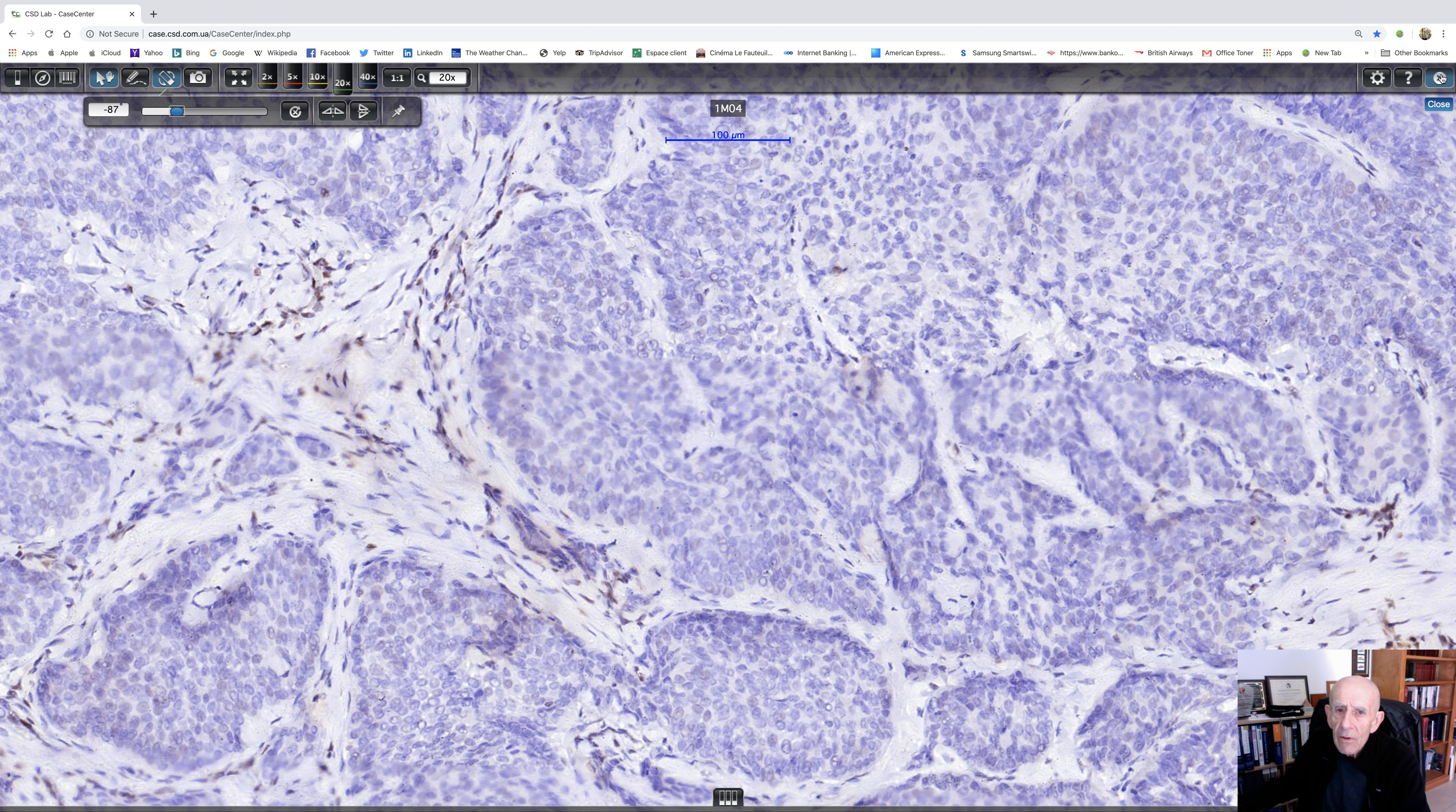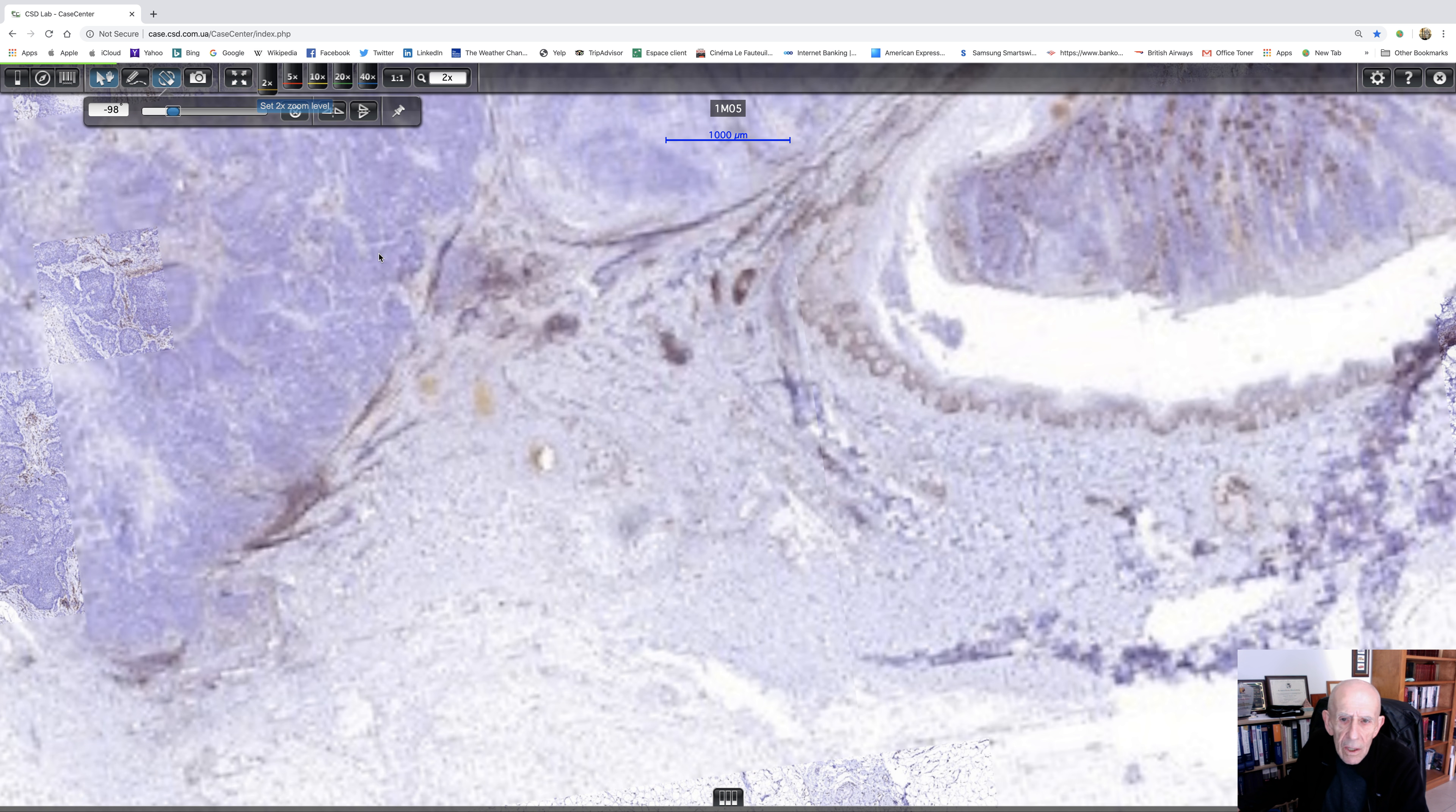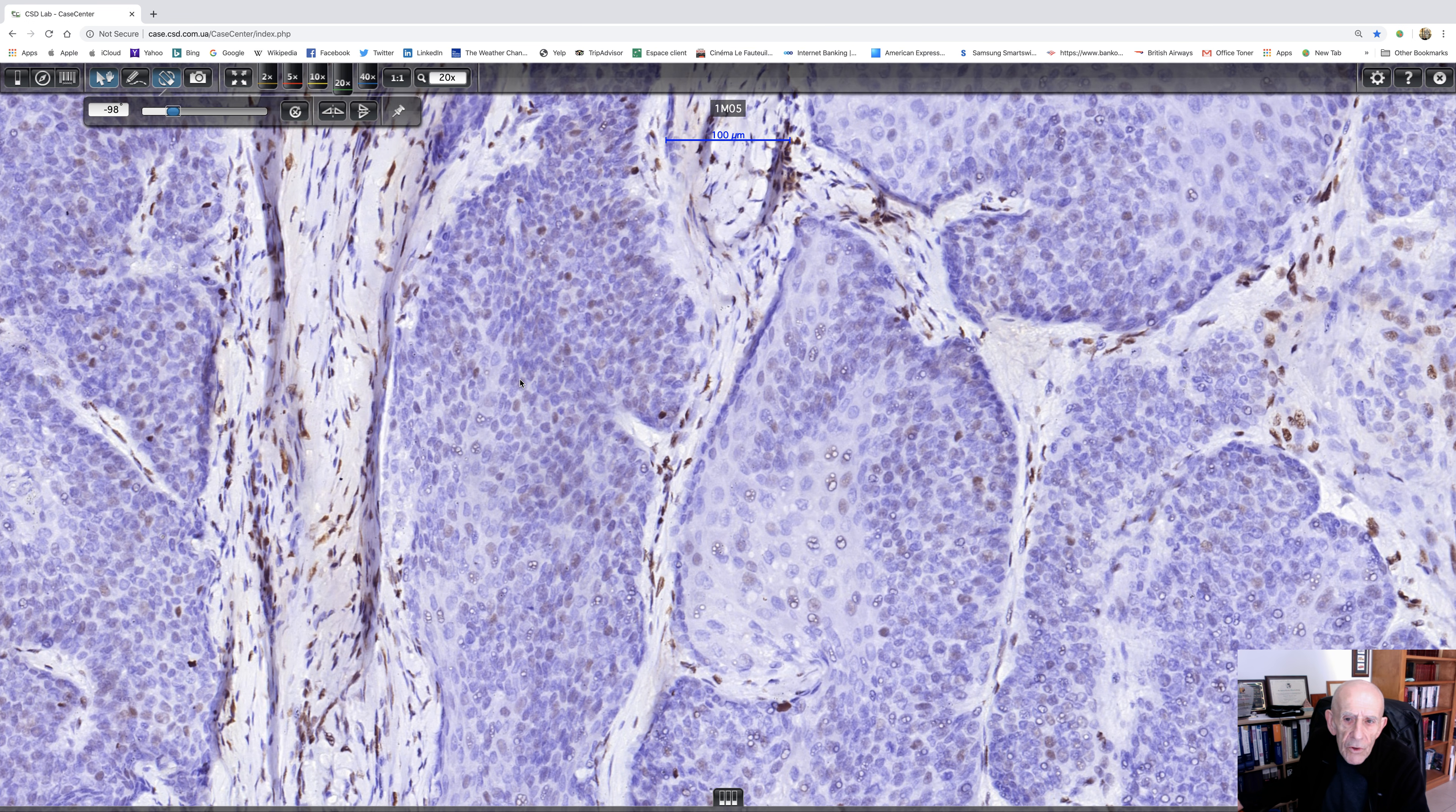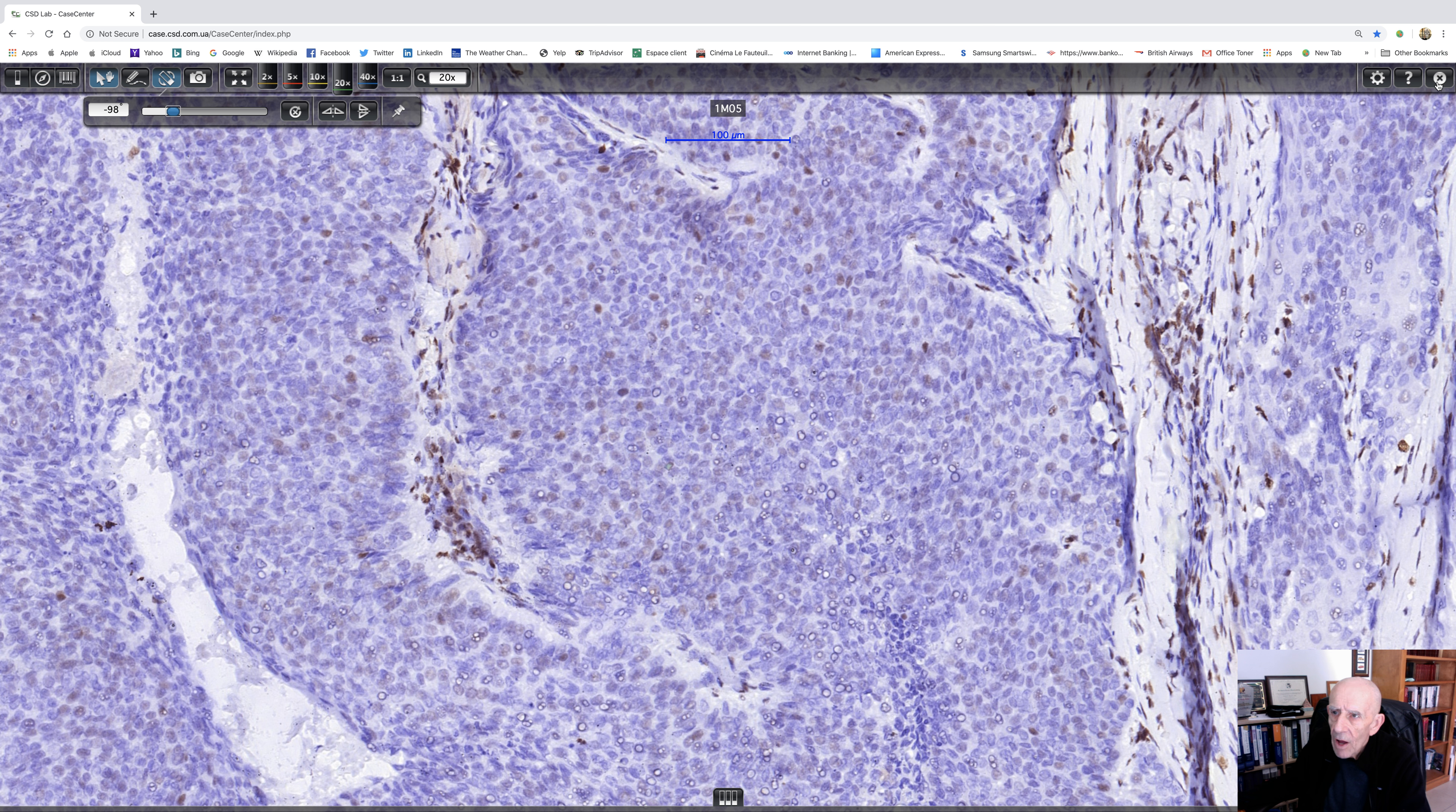And then we have another one to look at. Let me just see. MSH6. And there's MSH6 there. And I'll turn that one around. And we'll see what we've got here. And there's our nice internal control. This is all artifact, all these round blobs you see there. So one has to make sure one doesn't look at those. Otherwise, one will get completely confused. And there's... Well, there's certainly diminished expression. It's not completely lost because there are positive nuclei. But most of the tumor is negative. So I think we could say there's some loss. There's a bit more expression there. So it is reduced. That would probably be the best way to think of that one.